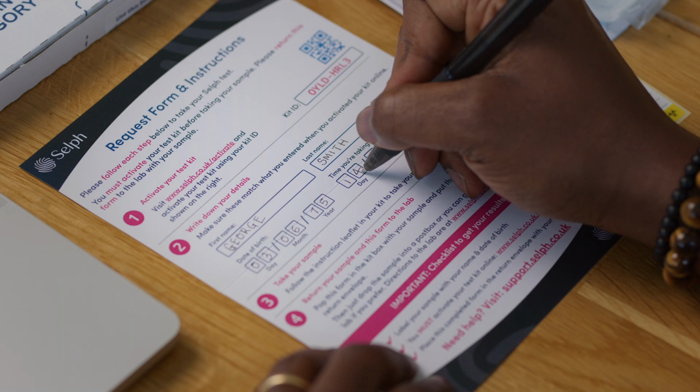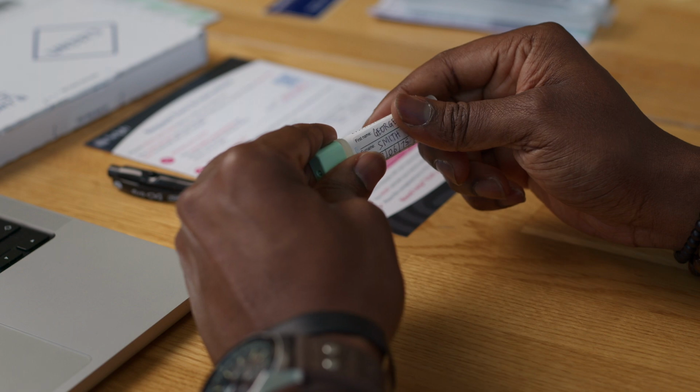Fill in your details on the sample label and test request form so we'll know the sample is yours. Stick your completed sample label onto the collection tube.